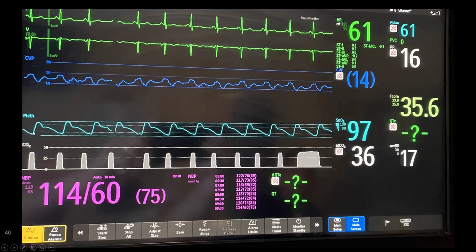So again, you guys should be able to recognize those and be able to tell what sensor, but also look at the CO2 down here. So again, if you're on APRV, you've got this really short release, short release, short release. I mean, yes, I recommend CO2 as a trending tool, so even in APRV, you can use it. But look at the one at the end here. What do you think we did? Why did we get a longer capnogram down here at the end?